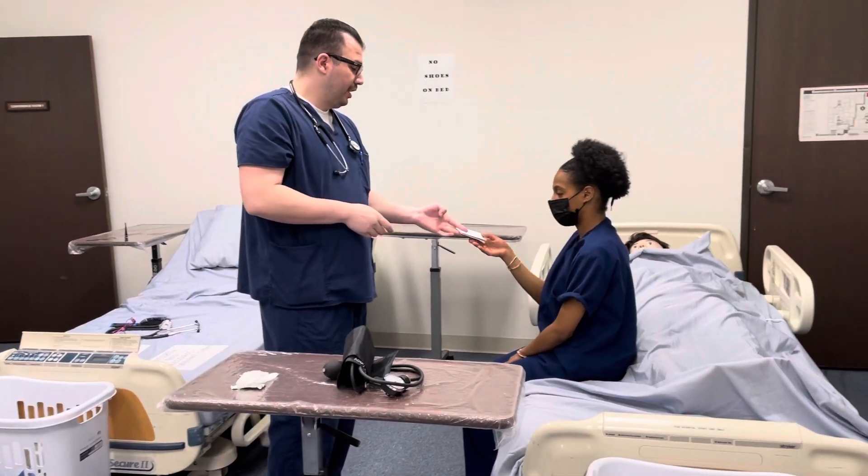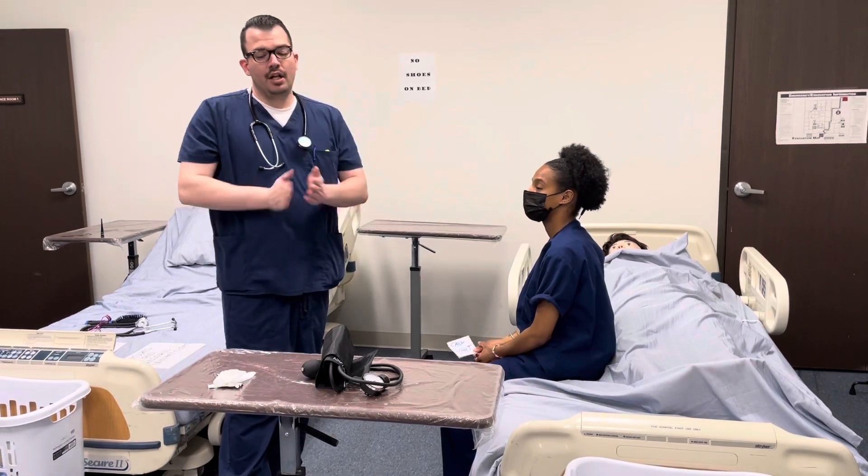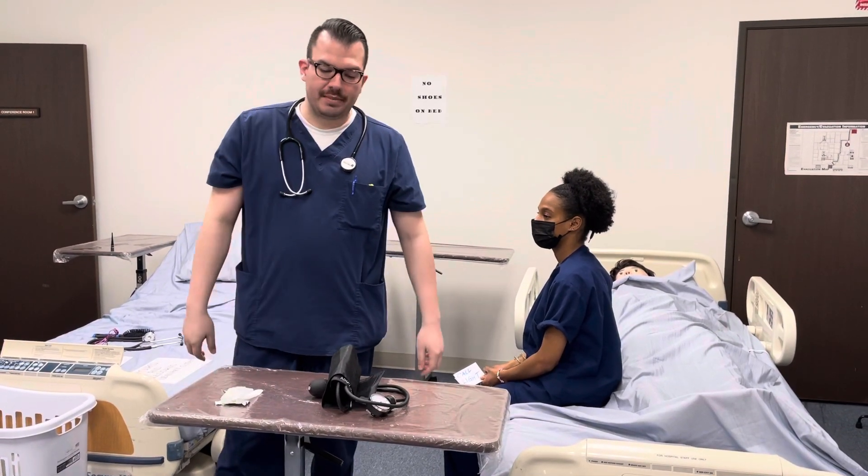Mrs. Smith, here is your call light. Should you need anything, please let me know. I'll go ahead and unlock the wheels on the bed, remove the privacy, wash my hands, and report and document my value in a fraction, and my scale is complete.